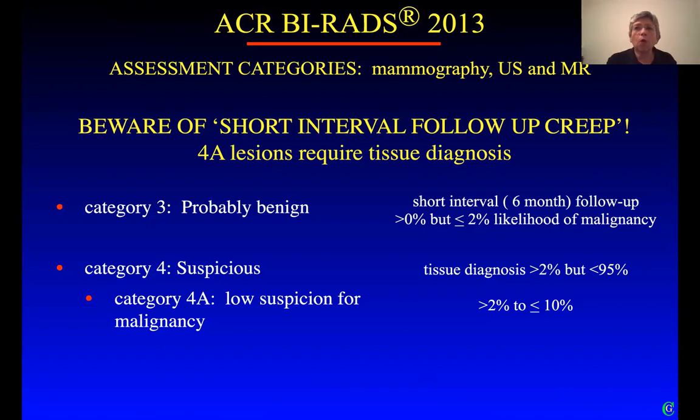I have just described to you the data that supports the BI-RADS 3 lesions. I have described and shown you examples of what these lesions look like. If you assign something to a BI-RADS 4, that requires tissue diagnosis. It is not appropriate to do short-term follow-up on the BI-RADS 4A lesions.